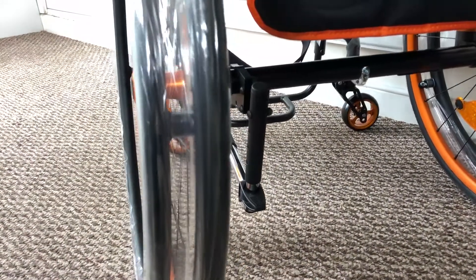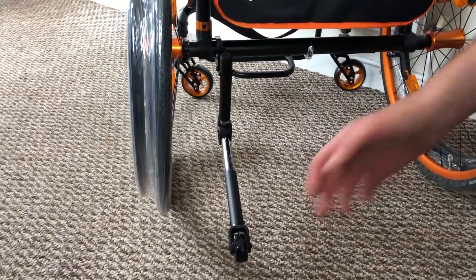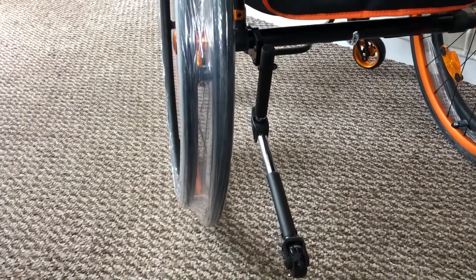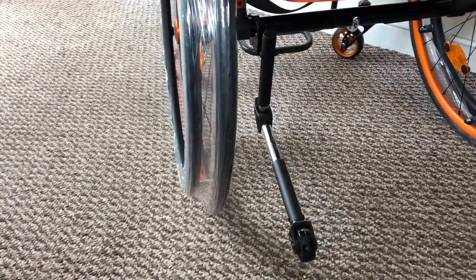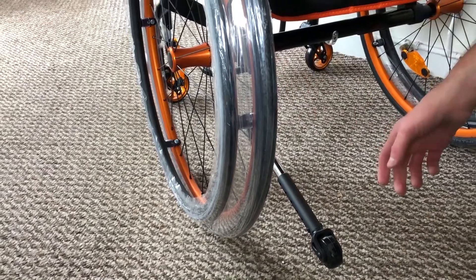The customer has gone for a swing-away anti-tip. Literally you'd put your foot — or the person behind you — on that and it swings around. You've then got an anti-tip, so should you tilt back or wheelie a little bit too much, you've got that extra security at the back should you want it. There is the ability to adjust it — you just press this button and slide it in and out to adjust.